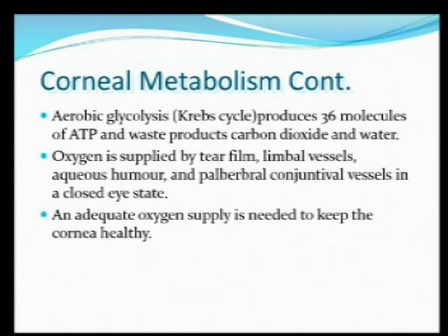Oxygen can come from the tear film, from the limbal vessels, from the aqueous, and even from the palpebral-conjunctival vessels when your eye is closed. But it's critical that we have enough oxygen if we want to keep the cornea healthy. And unfortunately, when we place a contact lens on the eye, we're putting a barrier between the number one source of oxygen and the cornea.